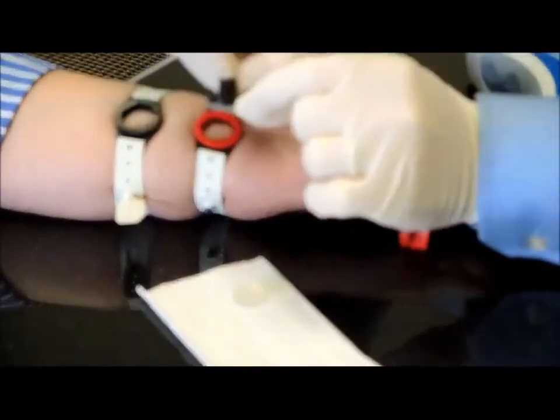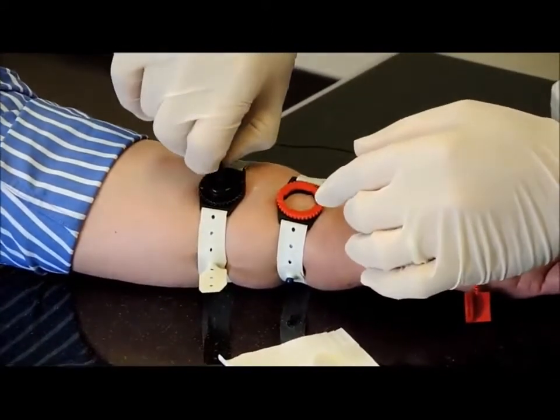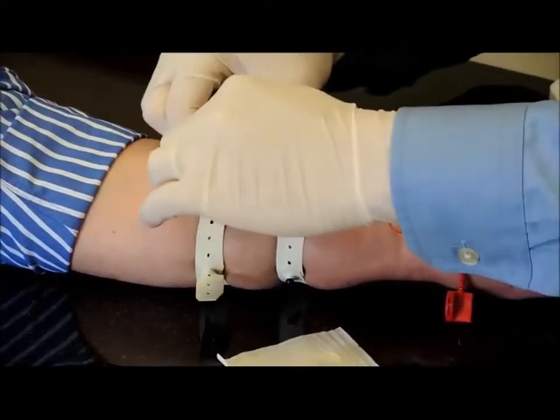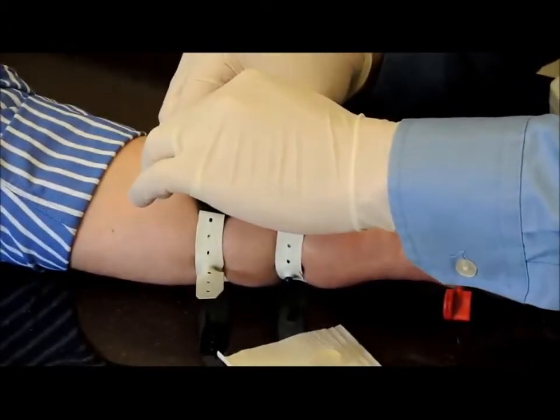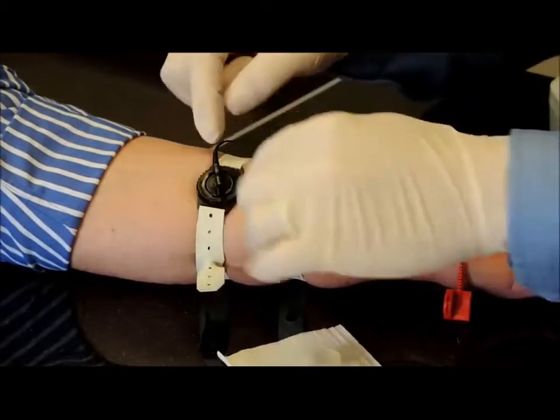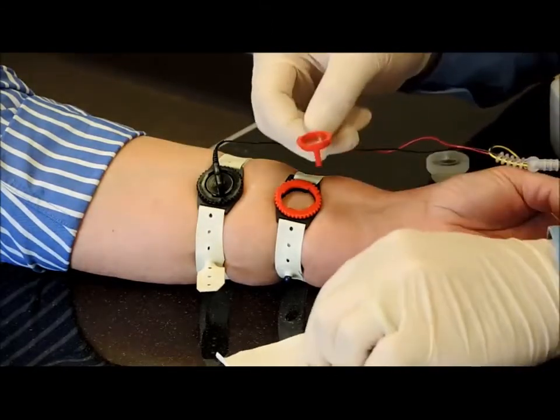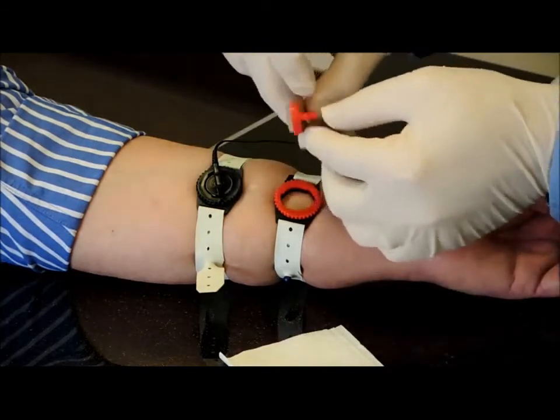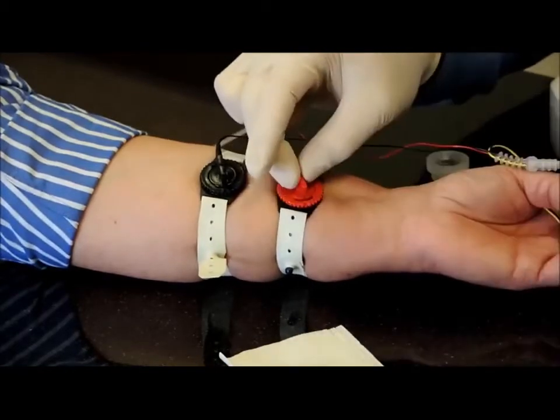Then I'll put that into the black holder, and you'll notice on these electrodes there's flanges that fit perfectly into the holder. You line that up and push down, and then you twist the ring about 45 degrees, and so it locks it in place. We'll do that with the red electrode as well. Put the disc in, and then twist the ring, and so it's locked in place.